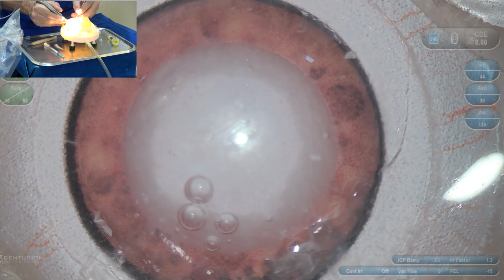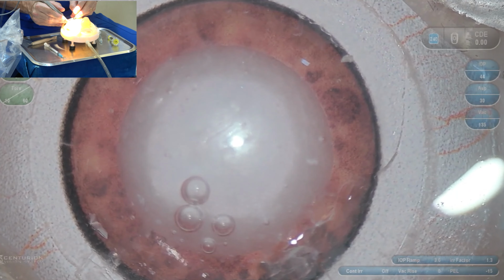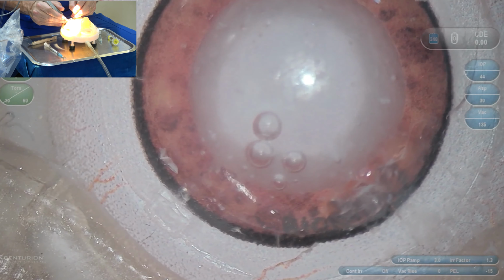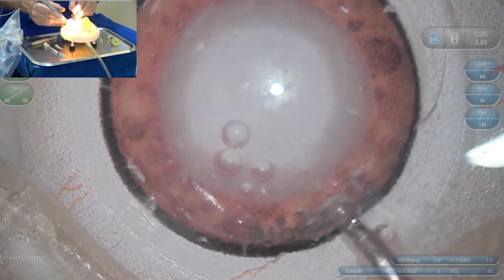Okay, and here the key is to go deep with both instruments and separate those fragments. Look at that. Look at that crack. It looks great, and you can train this very, very much. So we have already 2 halves.